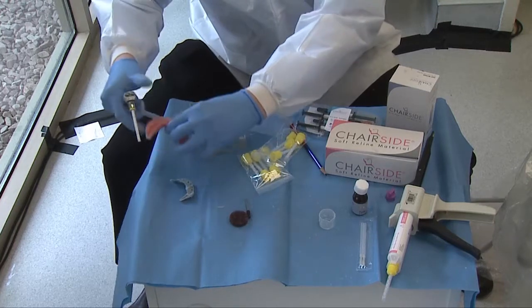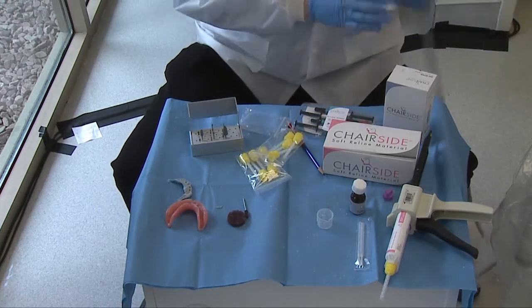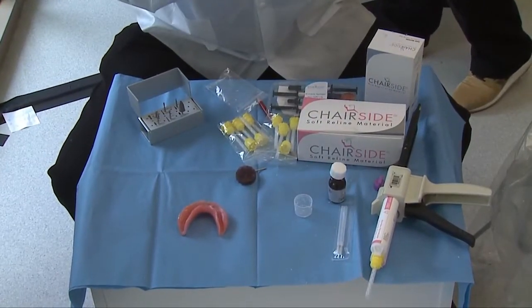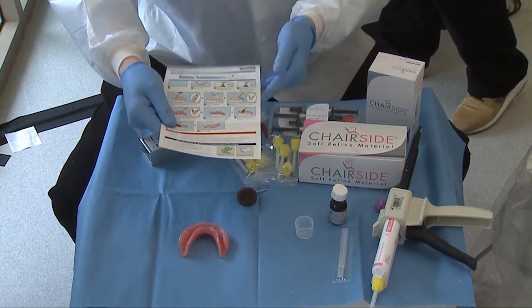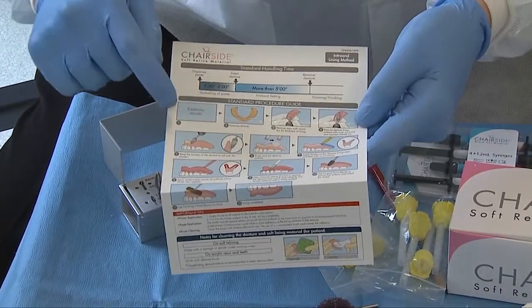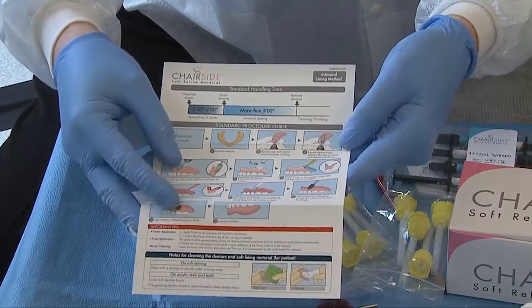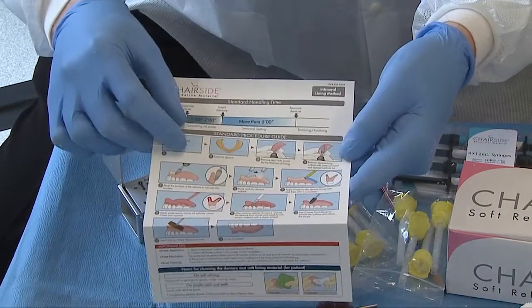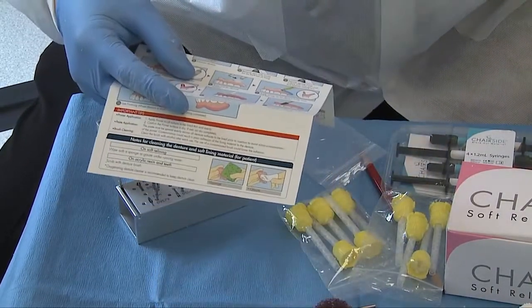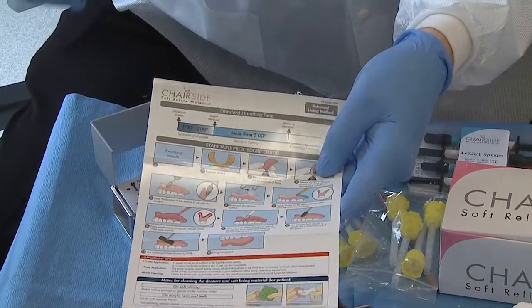Ideally, what I would do next is place my denture caps on top of the implants, but we're not going to do that today — that's a procedure done later on. Now, following our technique card, our intraoral method for a definitive soft reline — I'm not going to do as many border adjustments as indicated, but we'll do some so the soft liner holds in place. We need to create retention holes on the inside of the denture and bevel the outside part of the denture. I need to create a bevel, then put my primer and adhesive on, and then apply my chair-side soft material.